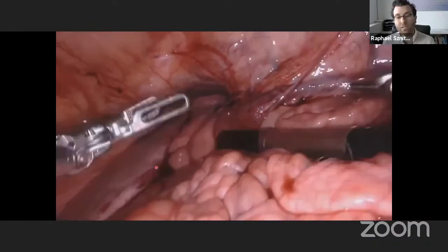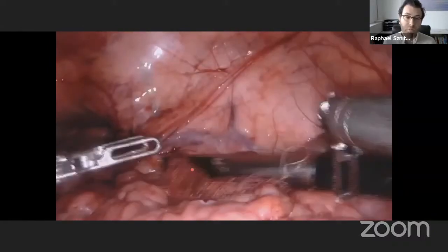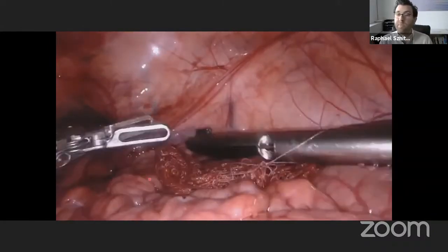You see tool interactions, and you see highly complex, deformable anatomy with shadows. Typically you can have blood, and changes of scenes, scales, focus, and so on. So really a rich environment of things happening. Over the last decade, there's been a trend to provide computer vision methods that can look at these video sequences and analyze them, either post hoc, meaning you have the whole sequence and want to say something about the content.